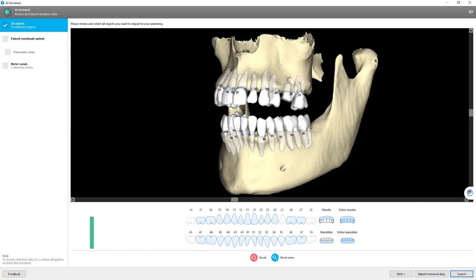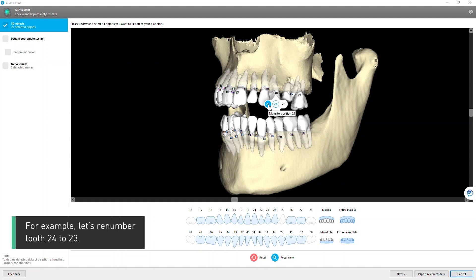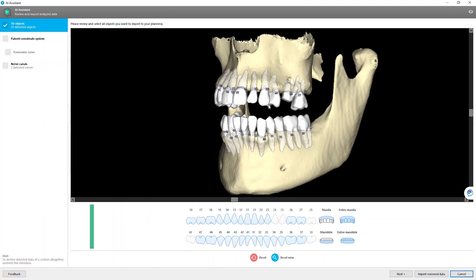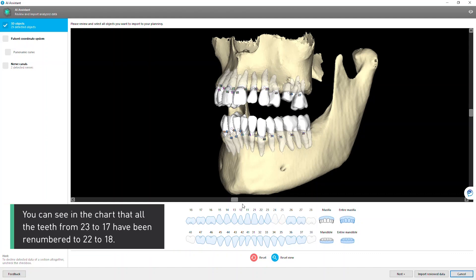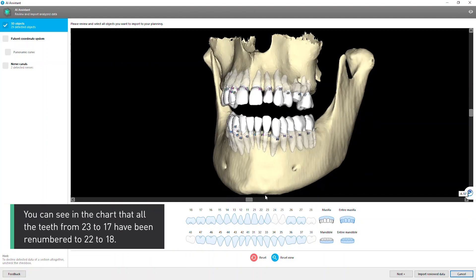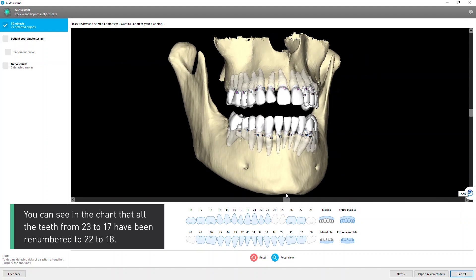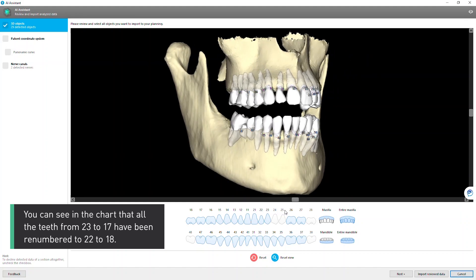For example, let's renumber tooth 24 to 23. You can see in the chart that all the teeth from 23 to 17 have been renumbered to 22 to 18.